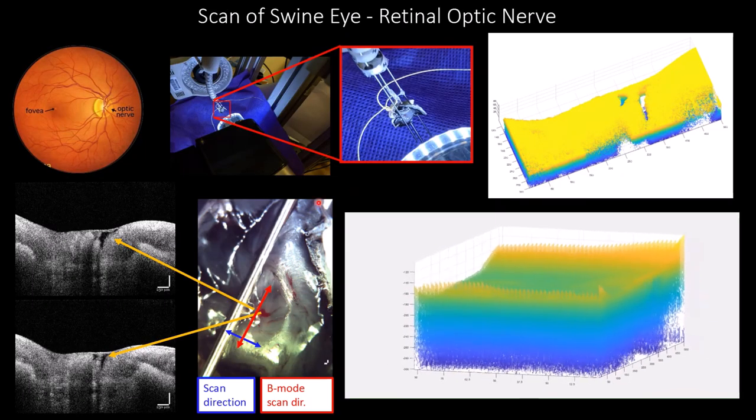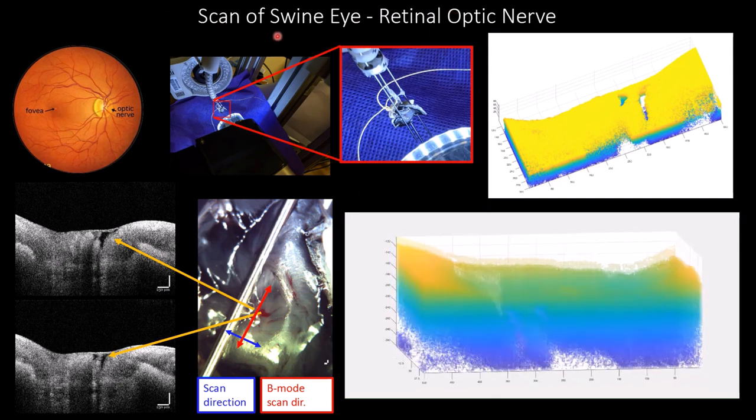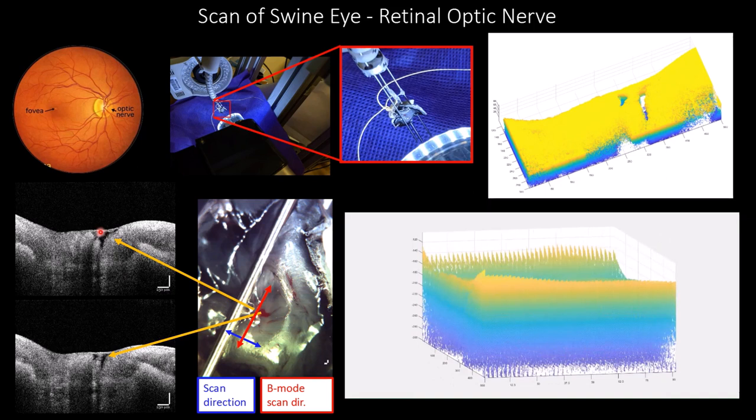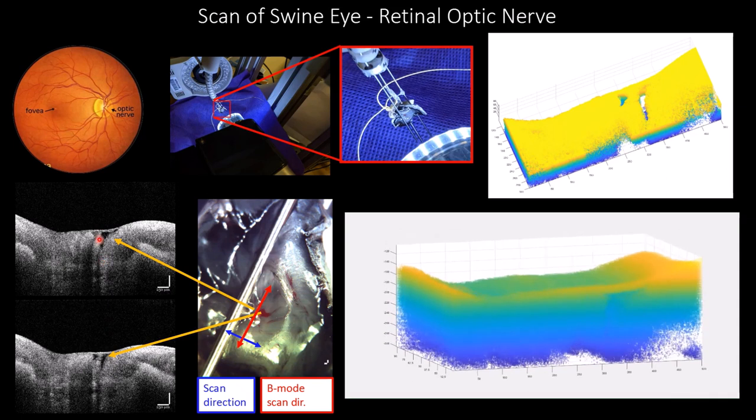And as a sample application, we looked at the feasibility of scanning the retinal nerve in a swine eye. This is an example here, and what you can see is the branching of the optic nerve. As you can see, these are 2 B-mode images. And on this side here, you can see the 3D reconstruction in one view showing the branching. And so you can see right now the 2 branches, and then later you will see it spin and show basically the one side where it exits with 1 branch.